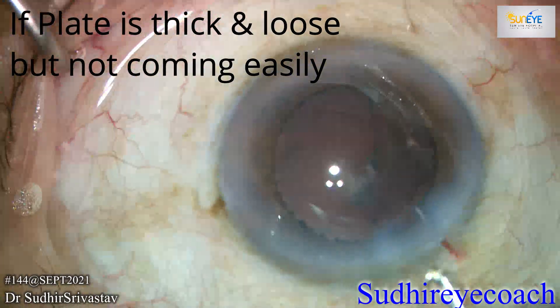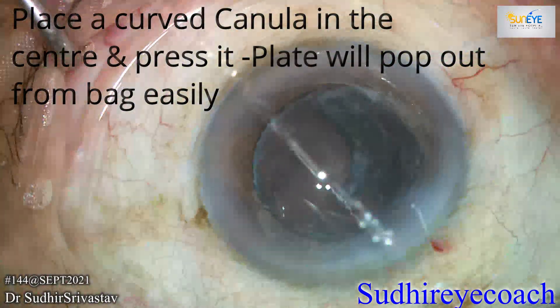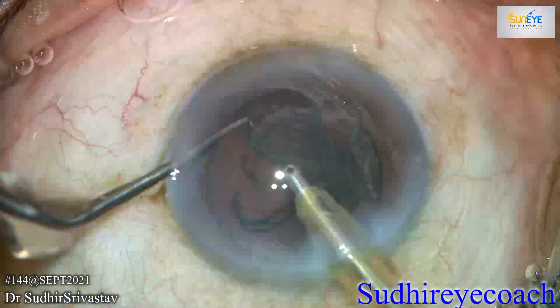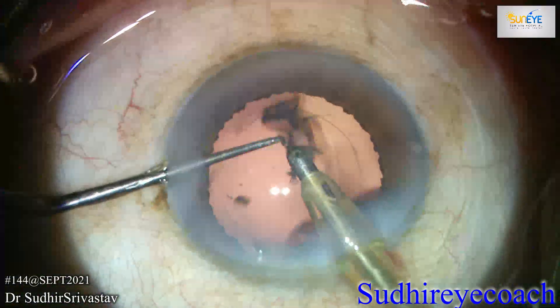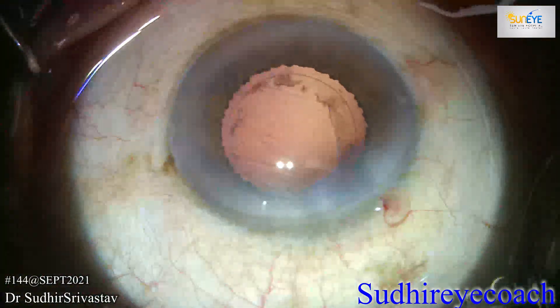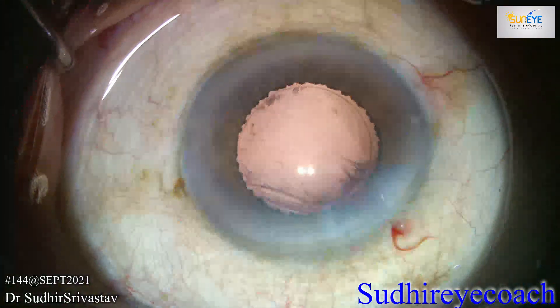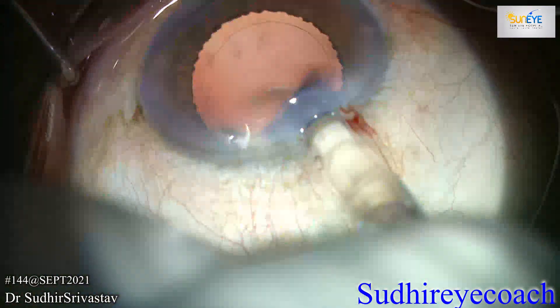In this case, there was a bulky epinuclear plate which was not easy to remove. So I put a bent curved cannula, placed it in the center of the epinuclear plate, and pressed it posteriorly. The whole epinuclear plate pops out from the capsule, and then you can place your IEA behind the plate and easily aspirate. These tips are very important because these are things we learn through experience — you won't find them written in books.